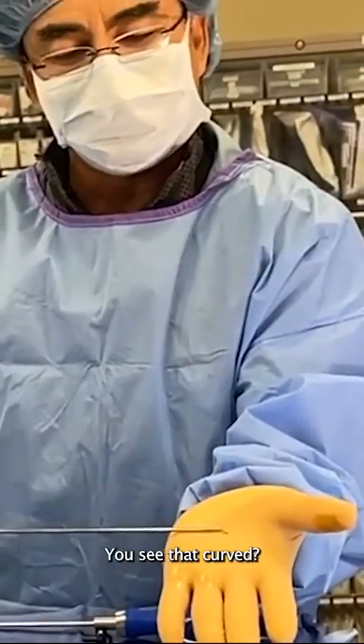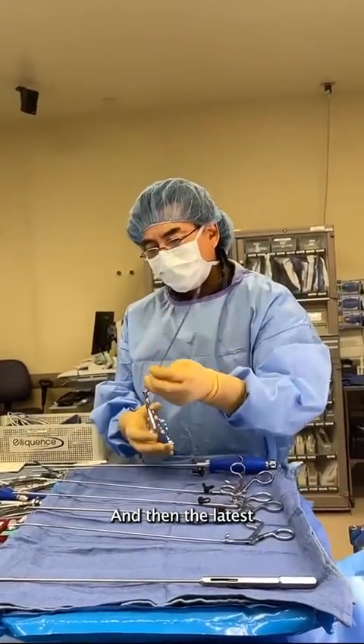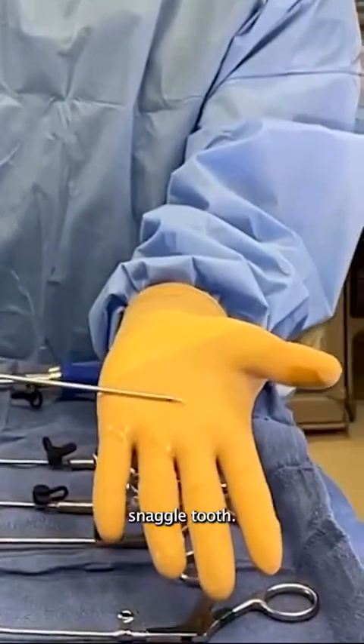The curved ball tip feeler — you see that? It's curved. We call that the Viagra. Don't ask us why, we just do. And then the latest: an articulating ball tip hook. You see that? We call this the snaggle tooth.